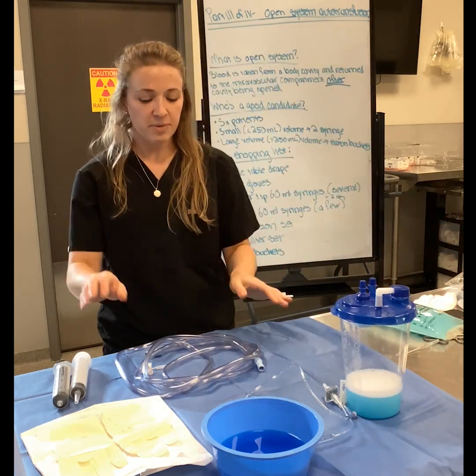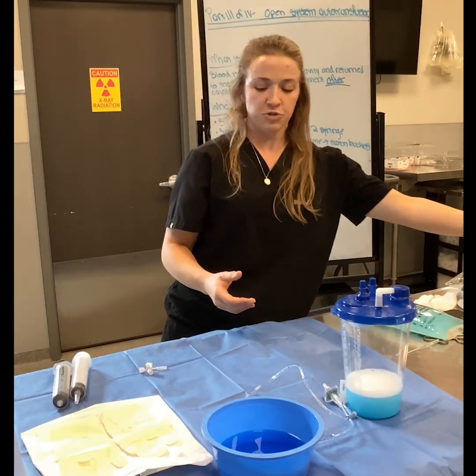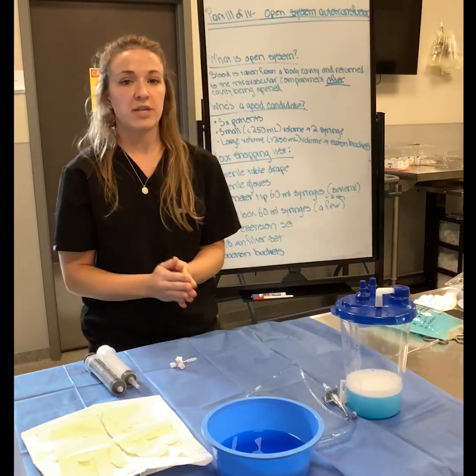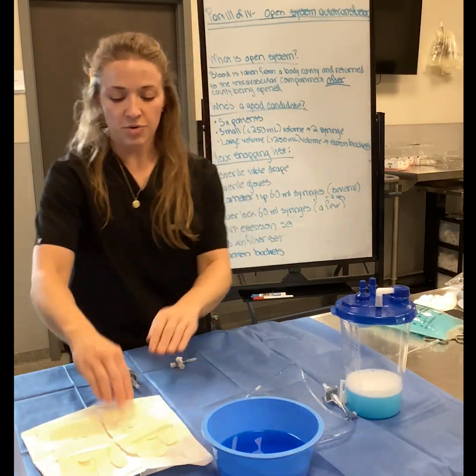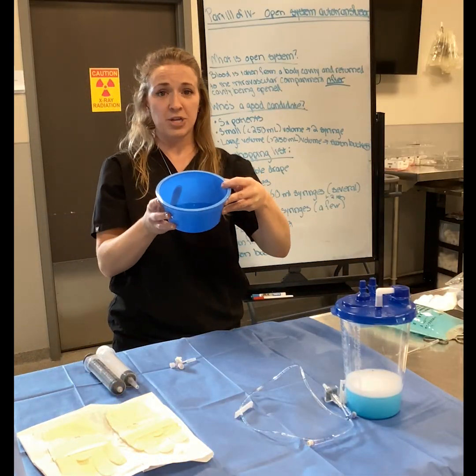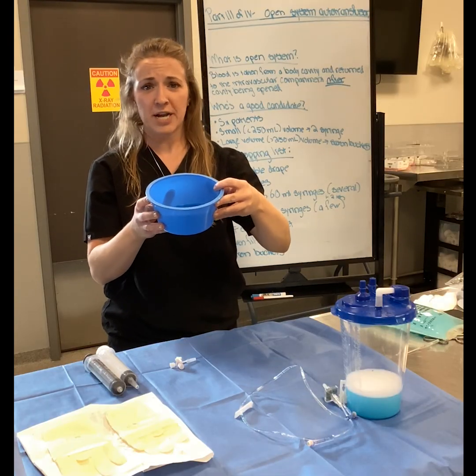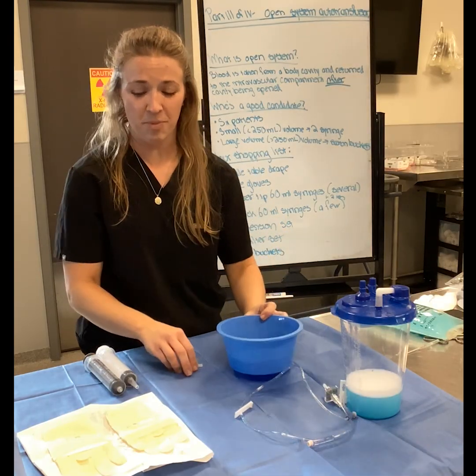So for purposes of demonstration and for ease on the eyes, I'm just going to remove some of these things from my table before I demonstrate the 2-syringe technique. So I'm going to pretend here for the purposes of today that this is my patient with their blood in their belly or blood in their chest. It's very deoxygenated. This patient needs lots of help, okay?